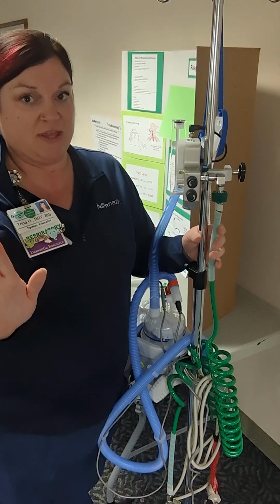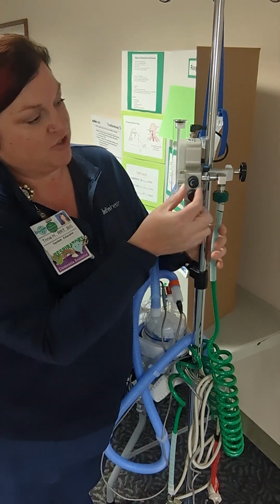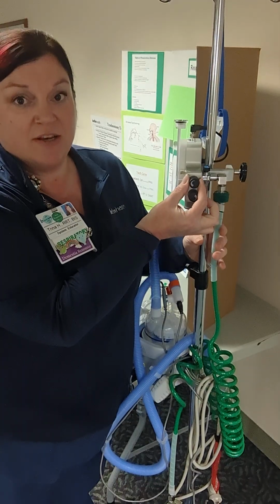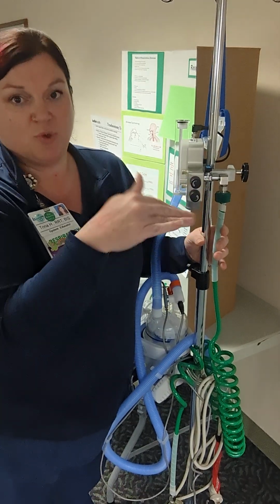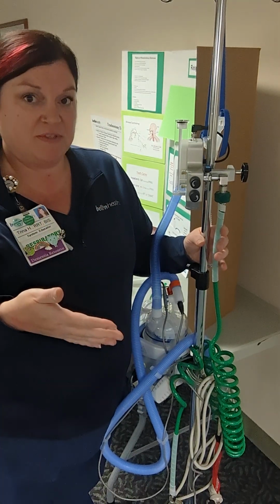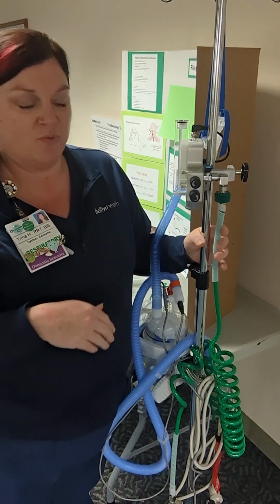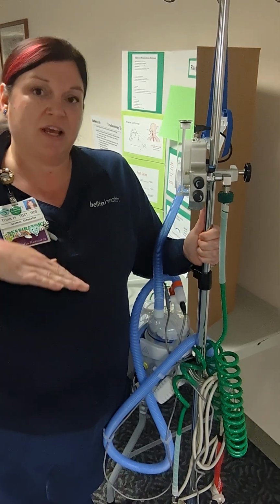We're not going to mess with that. We are just going to dial in exactly what we want. So our top dial is for oxygen, FiO2. The bottom dial is for our flow, 20, 30, 40, 50, 60 liters of flow. We never go above 60, hard and fast rule. We don't do that. Usually we're going to start around 40 liters and go up.